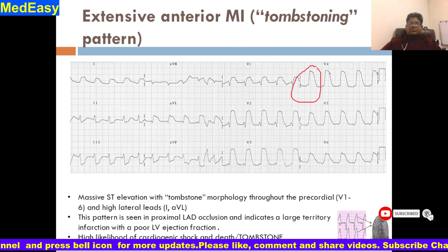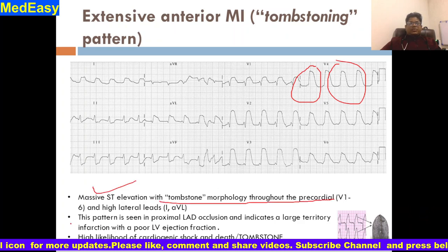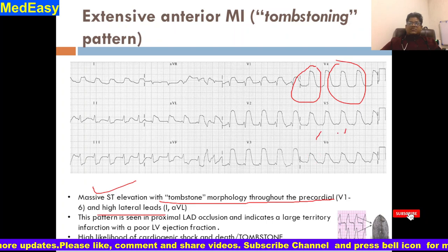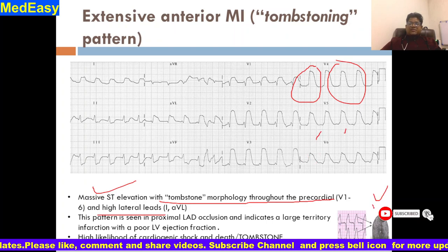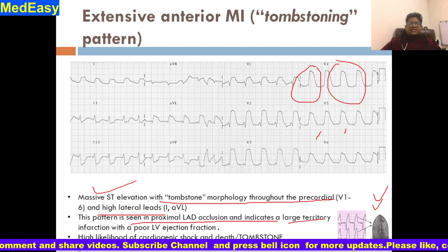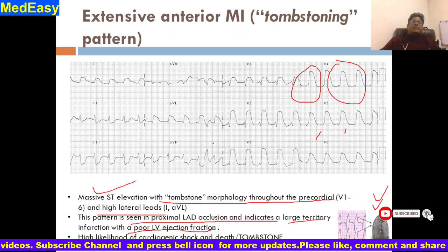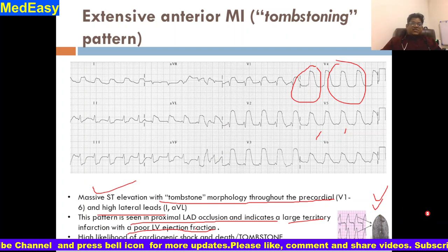This is the typical tombstone pattern — massive ST elevation with tombstone morphology seen from V1 to V6 and the high lateral leads. This pattern is seen in proximal LAD occlusion and indicates a large territory infarct with poor LV ejection fraction. There is huge damage to the myocardium leading to very poor ejection fraction.